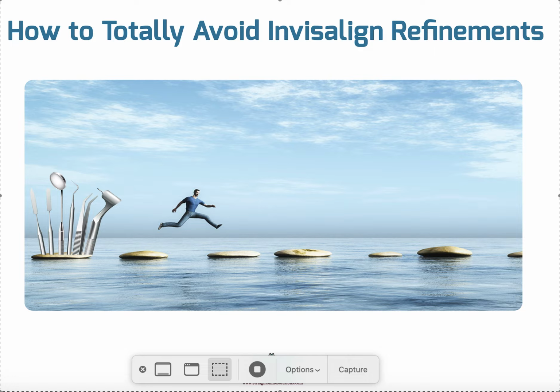Okay, more stones, smaller strides. You can ask for it. All you have to do is ask for it. So what I'll do is I'll take a plan and I'll optimize it. I'll get it so I love the movements. Looks great. Looks predictable. This will happen. This is possible, you know, with the attachments we have on and the movements and everything like that.